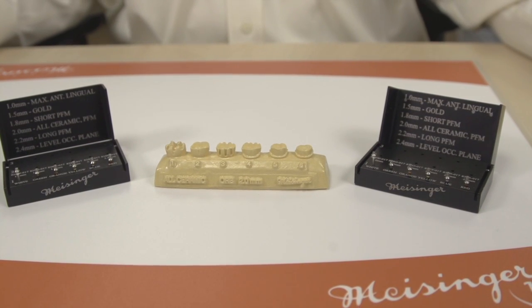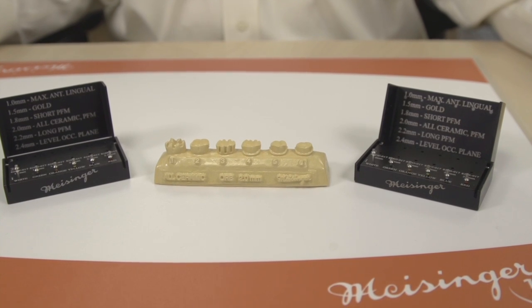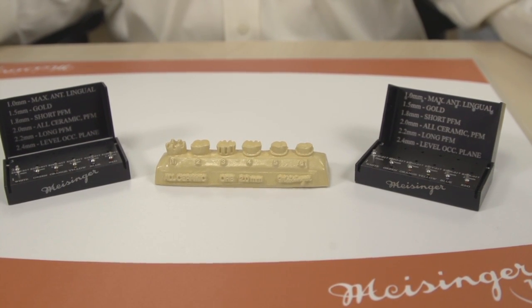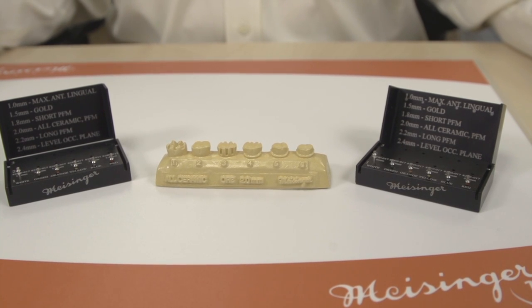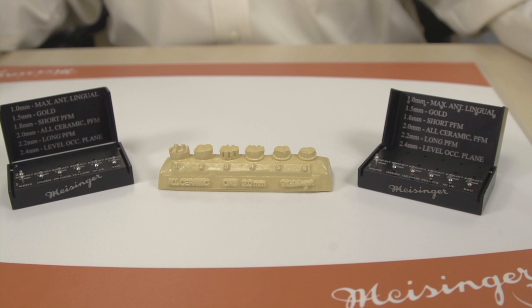One of the things that labs will tell you is that doctors either over- or under-reduce the occlusal surface. Now with new CAD-CAM technology, the proper occlusal reduction is critical for the ultimate crown preparation.